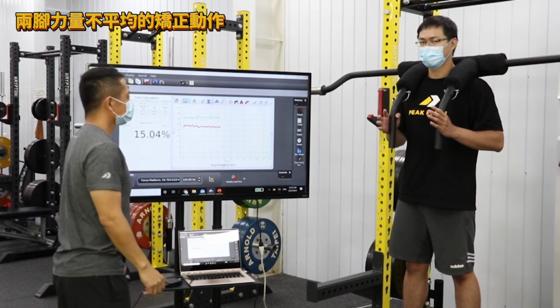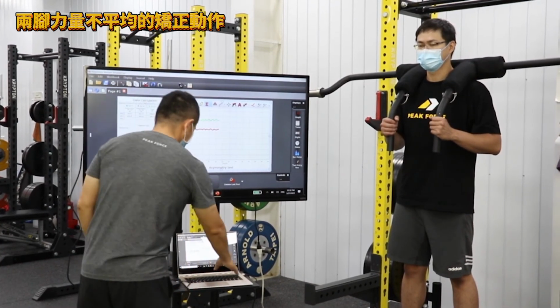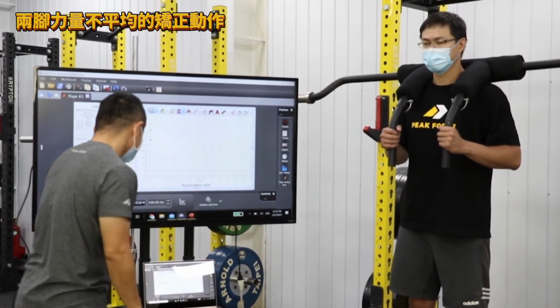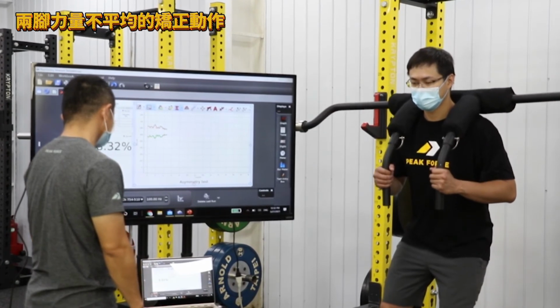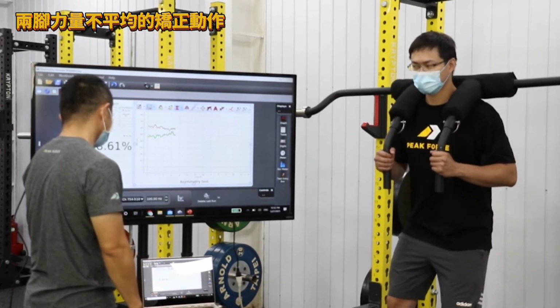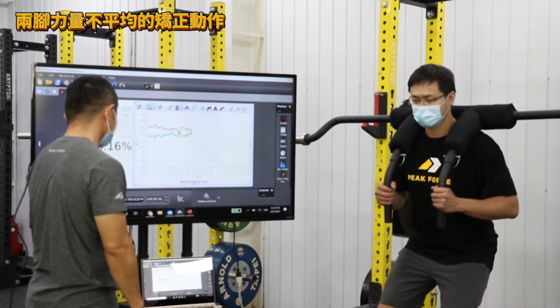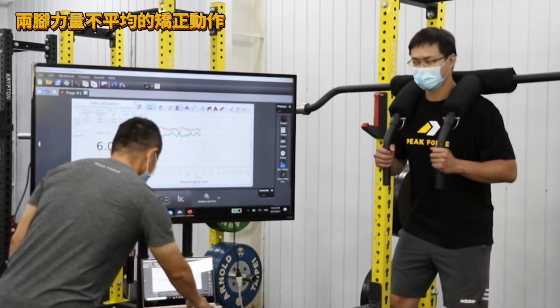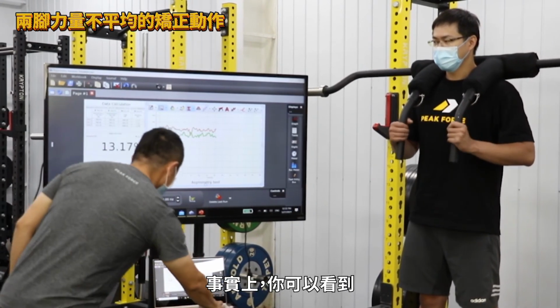好，等一下我会做一个慢动作深蹲，那大概是1/4蹲而已。Okay. Alright. 3, 2, 1, go. Slow, slow, slow, slow. Good. Up. And then one more. Slow, slow, slow, slow. Up. Okay. Good.